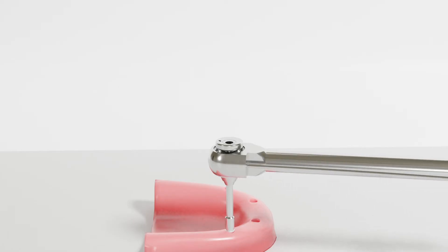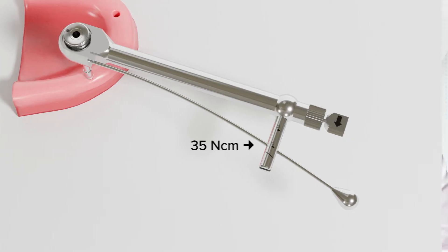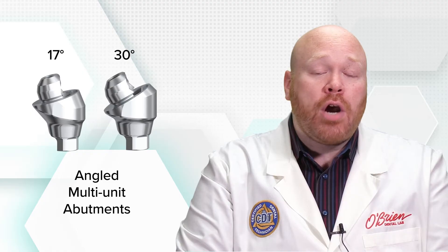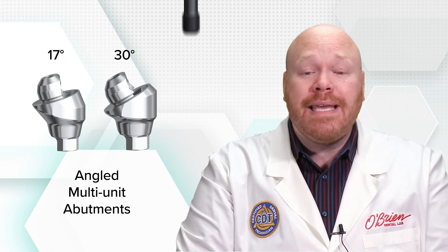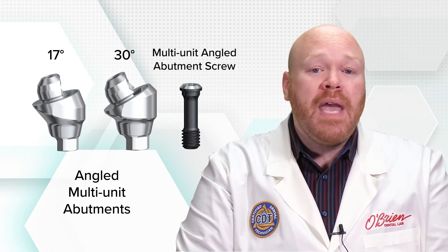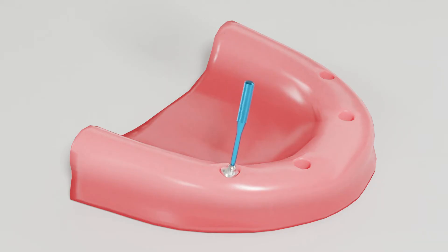The recommended torque for the straight multi-unit abutments is 35 newton centimeters for all Nobel implant systems. The angled multi-unit abutments are available in both 17 and 30 degree angulations and have an engaging connection to the implant, with a screw that is independent from the abutment. The angled multi-unit abutments come with a pre-mounted metal holder, as opposed to the plastic one. The holder is used to transfer the abutment to the implant and also makes it easier to rotate the abutment to the desired position before torquing the screw.